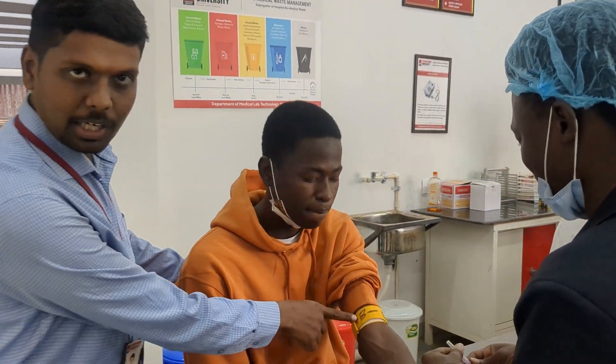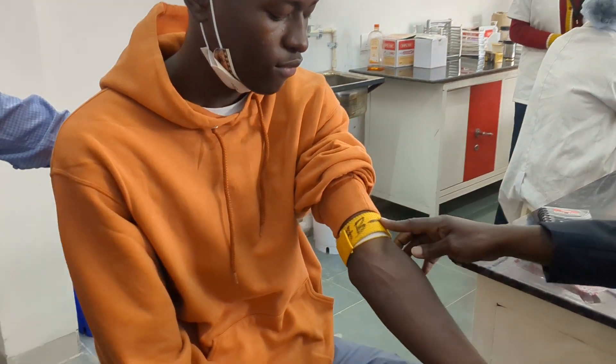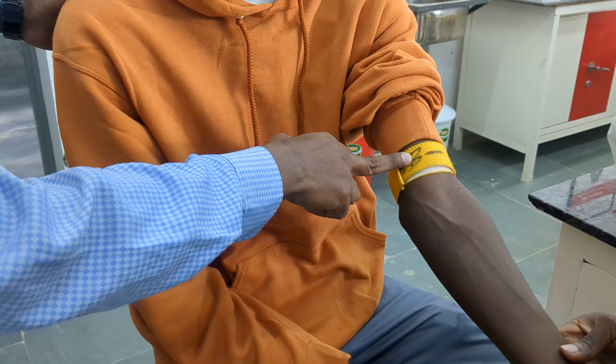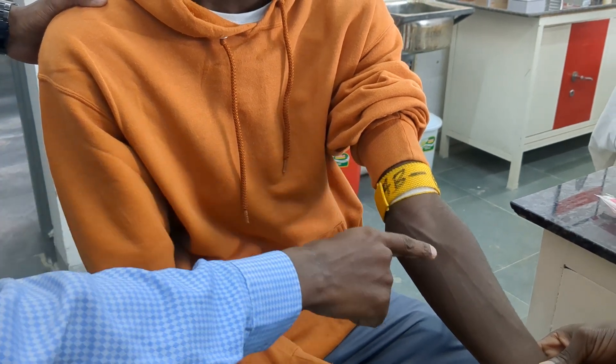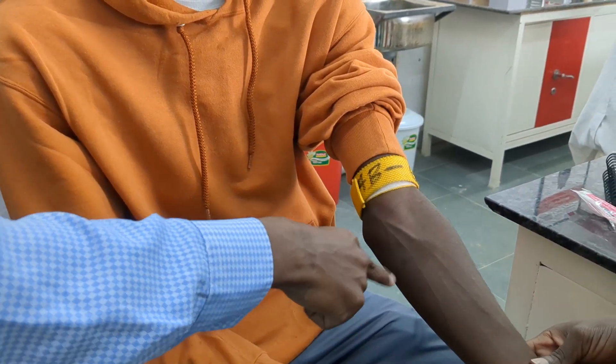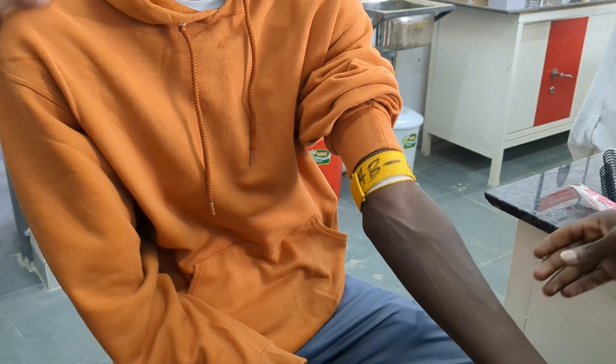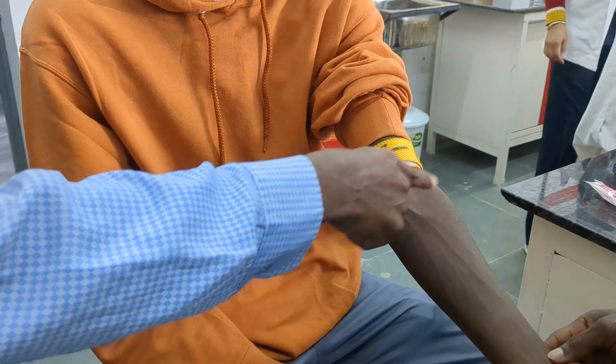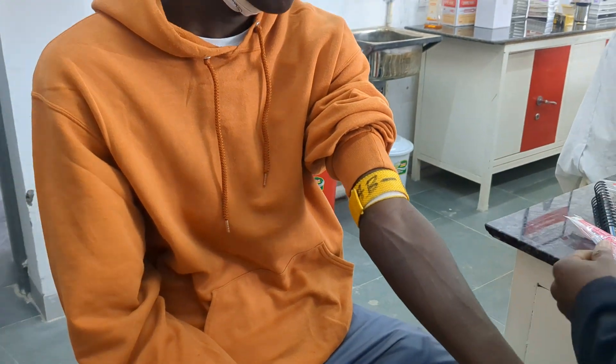First, we need to apply the tourniquet. We need to ensure that the patient is resting comfortably and then tie the tourniquet. Identify the vein and clean the site with a cotton swab. Mukhtar has already cleaned with the cotton swab. Then identify the vein and start collecting the blood.